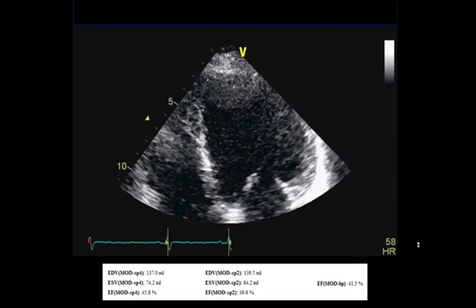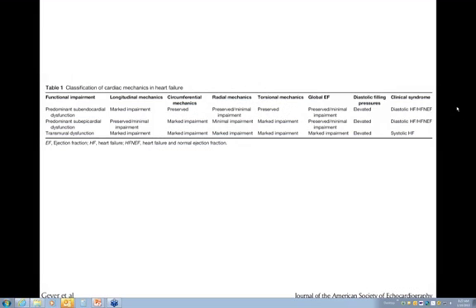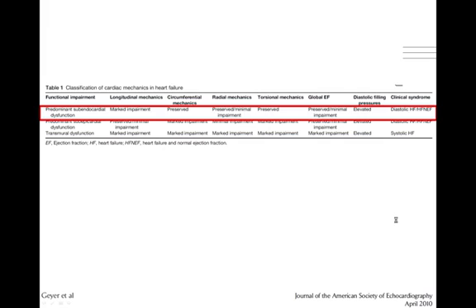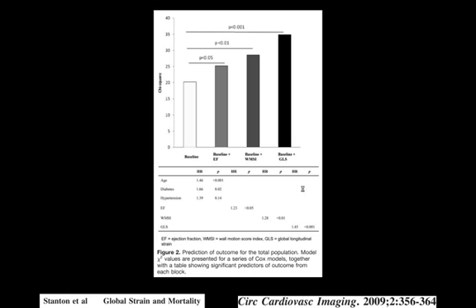This is kind of bread and butter use of strain, and I would like to go beyond that to show that I think of strain as a very powerful measure. It's been shown to be very strong, even for prediction of outcomes in a general population.